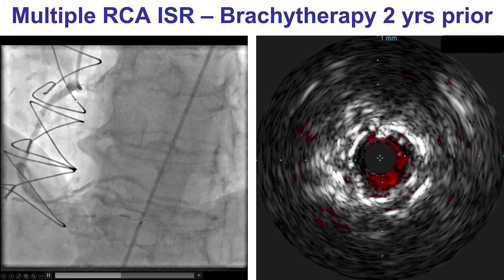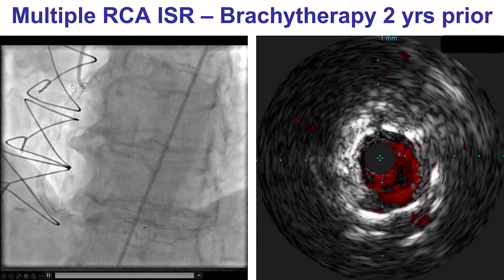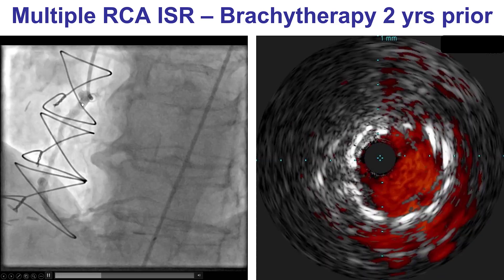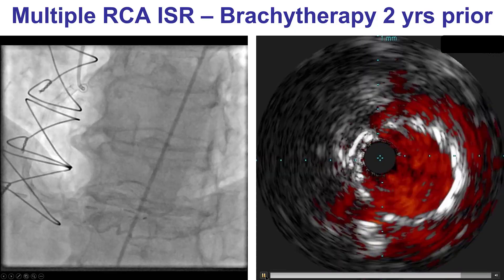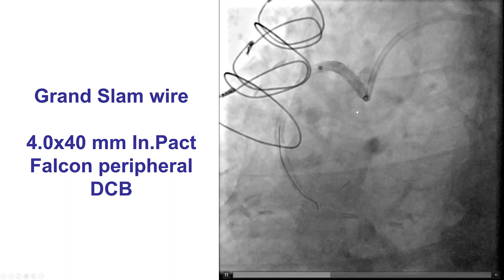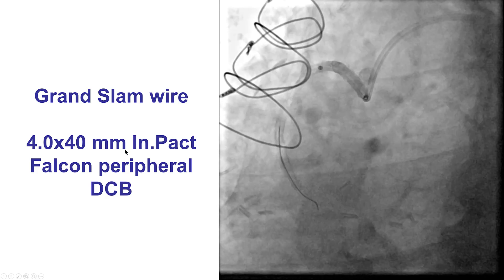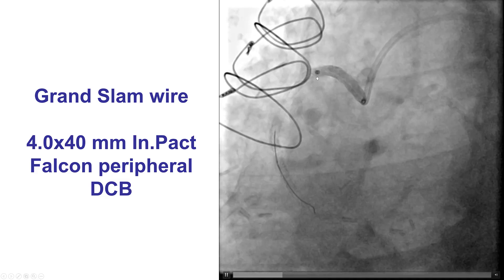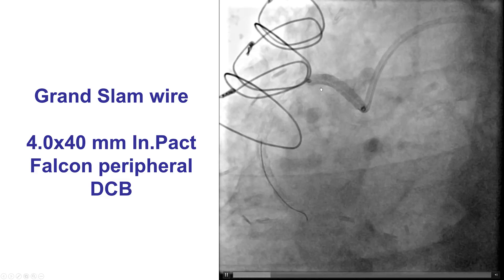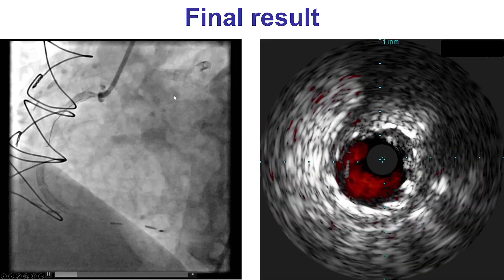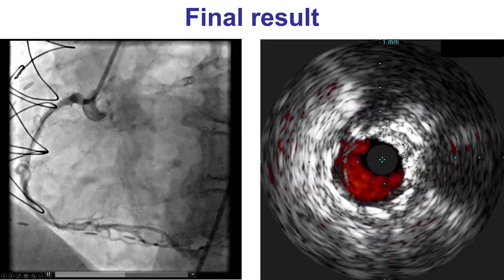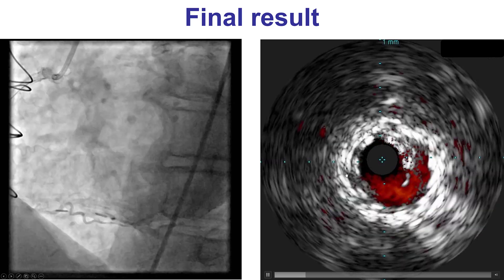This is an example of a patient who had recurrent restenosis of the proximal RCA with multiple layers of stent and underwent brachytherapy with off-label use of a peripheral Impact Falcon balloon. These balloons are extremely bulky — these are 0.035 balloons, very hard to deliver — and you can see it could barely be delivered in the proximal RCA. However, it was successful, and the patient did well without recurrent restenosis for two years.